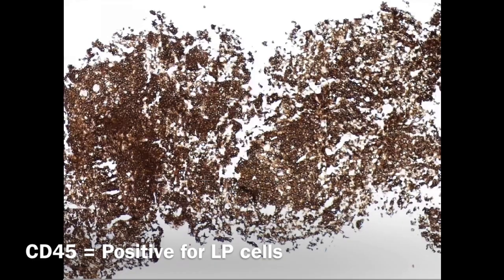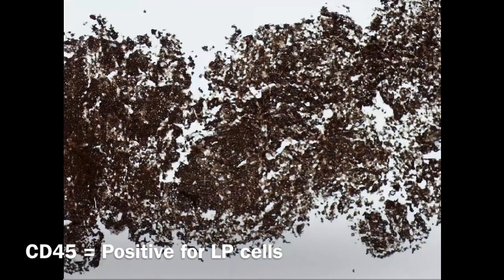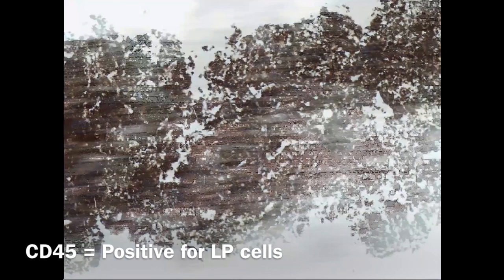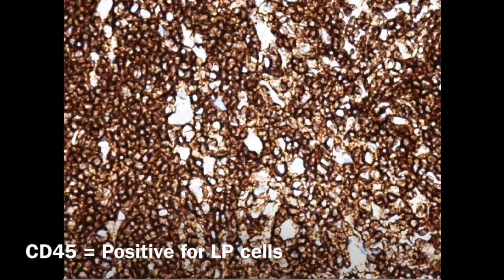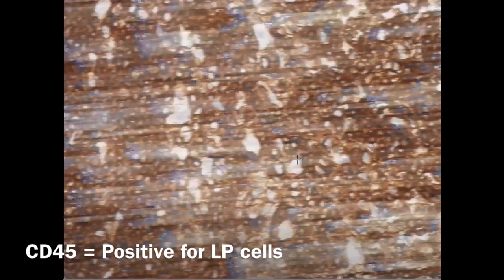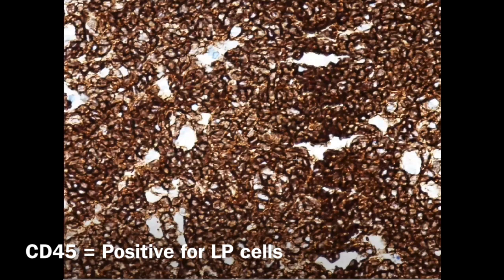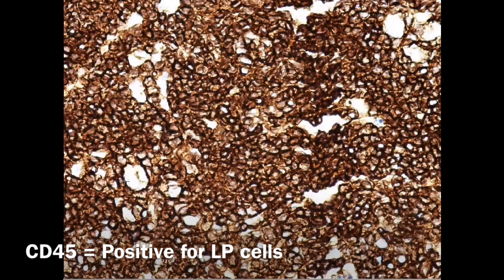Now let's take a look at the CD45. CD45 was negative in the classic type, and here it's the reverse — it's positive for LP cells. Here at 40x, this is a big cell and as you can see the membrane is deeply stained with CD45. Please compare it with the other video. See here how the membrane is deeply stained — a perfect line of deep stain for the CD45.